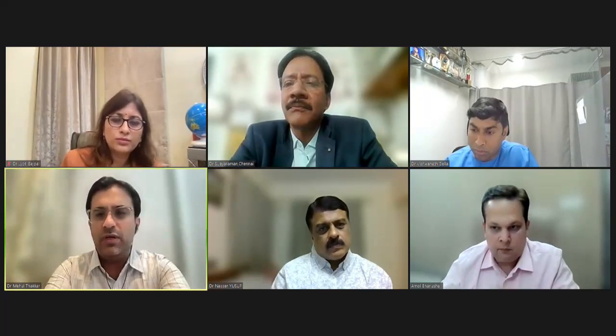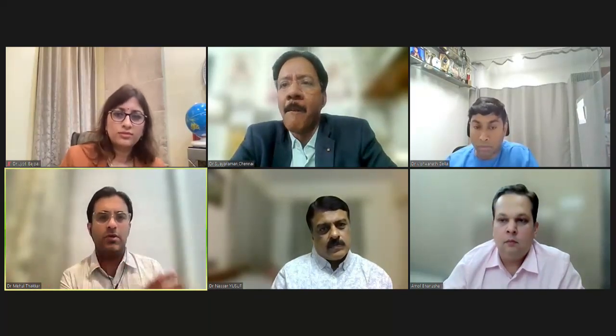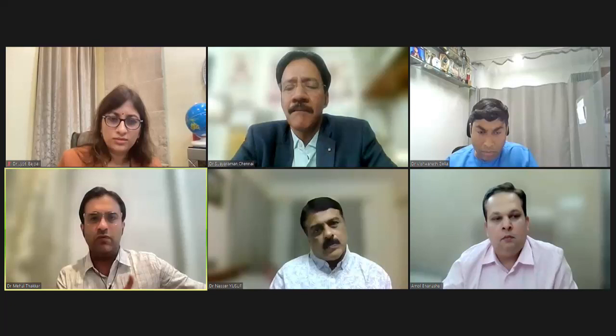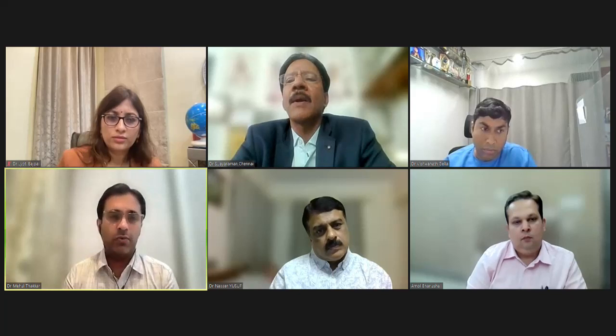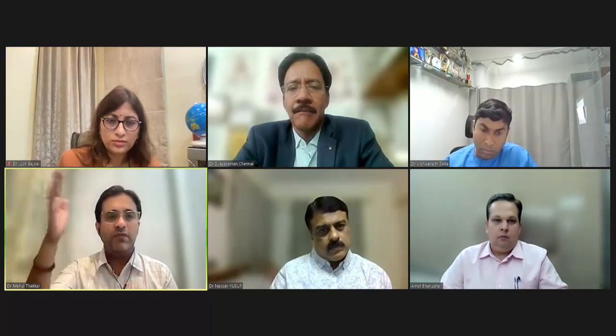So if I have to summarize this, maybe if you have a rigid thoracoscope, then probably you don't have to worry about getting a cryobiopsy or anything. But if you have a semi-rigid thoracoscope and maybe your pathologist has not been happy with the last results that you have given and your suspicion of malignancy is high, maybe then you might want to use the cryoprobe. On table, you might want to decide, okay, this looks more malignant. I thought it was tuberculous, but it looks more malignant. I need to use a cryoprobe. So if you have the machinery with you, then you can choose. I would suggest don't go with the fixed mind that I'm going to do a cryobiopsy in this patient. Maybe take the decision on table.